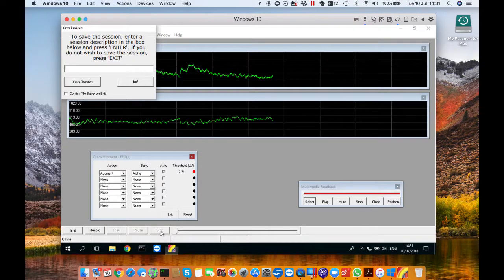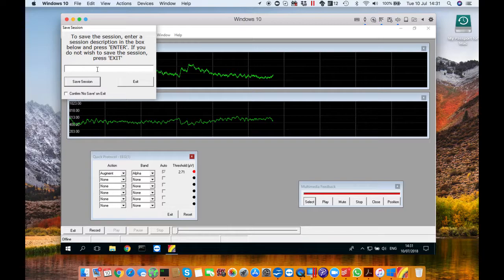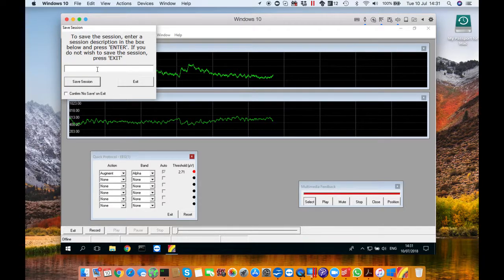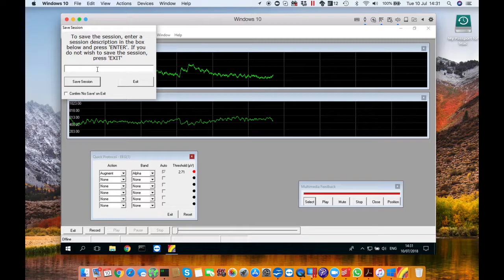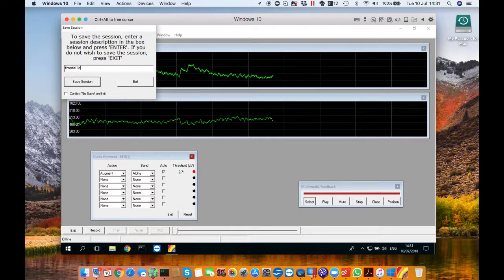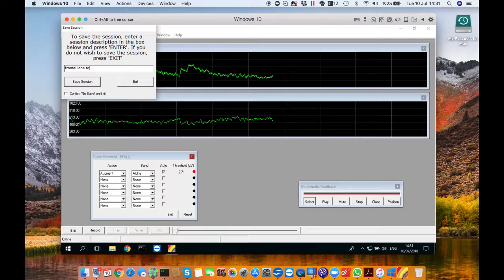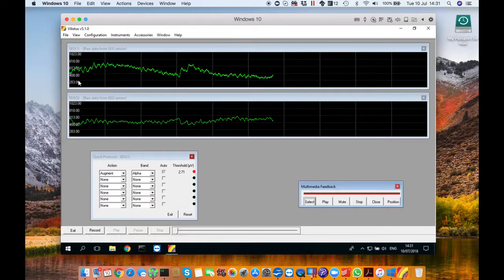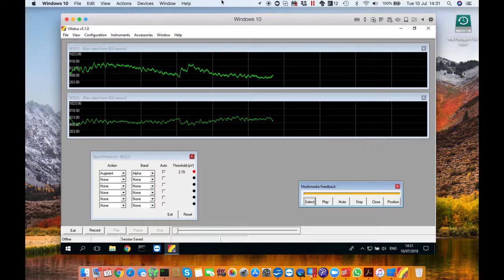When you finish press stop and a little save window will appear in the top left hand corner. You can name the session whatever you want. I'm calling it frontal lobe test and then just when you've done that press save session and that is quick protocol done.